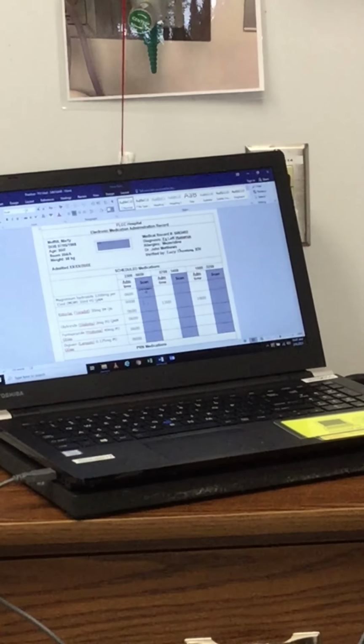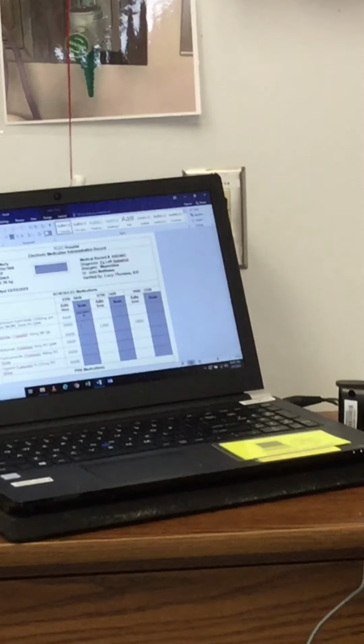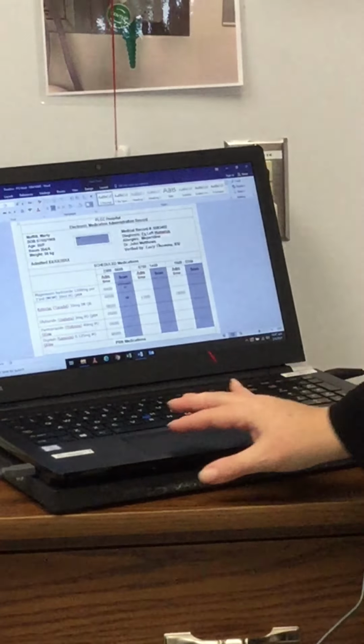and go to the next one. All right, I have ketorolac, 30 milligrams IM every 6 hours. Let's do it 0600. This is 15 milligrams per ml. I have 2 mLs. It's labeled, and there are 2 mLs. No bubbles. And I'm going to scan the barcode. Okay.